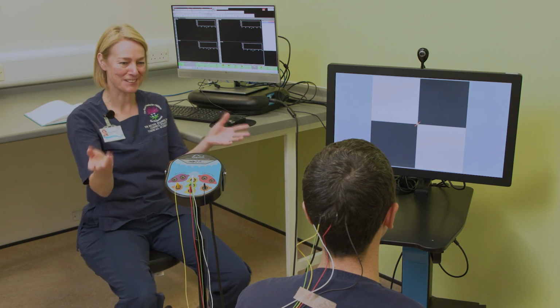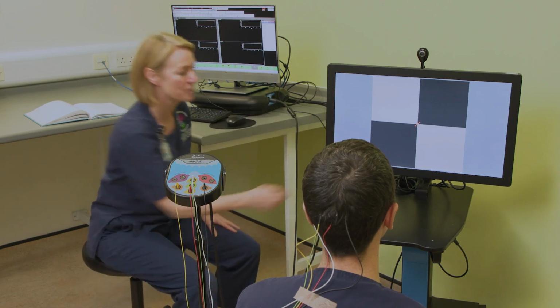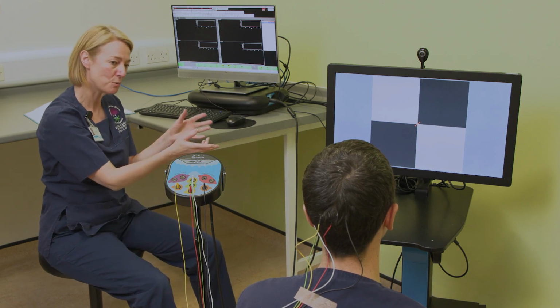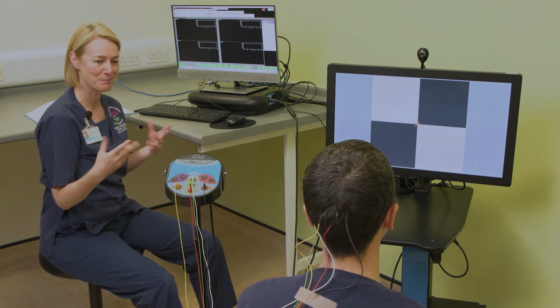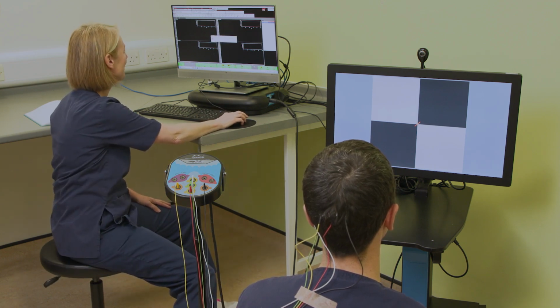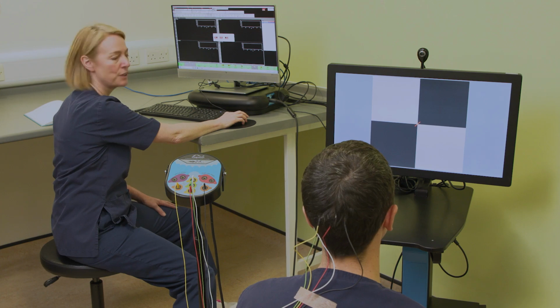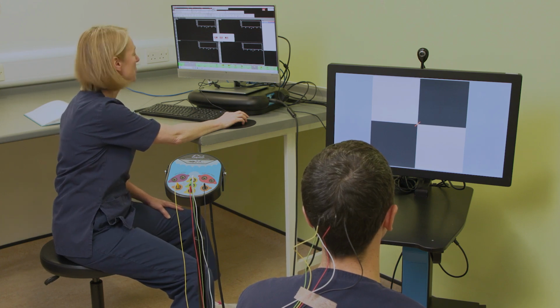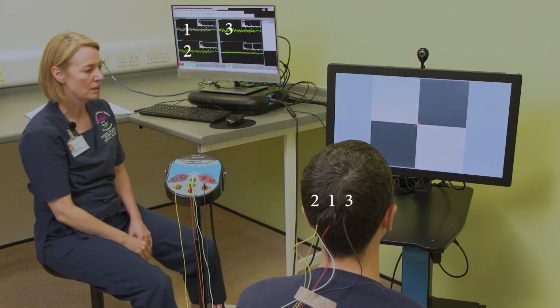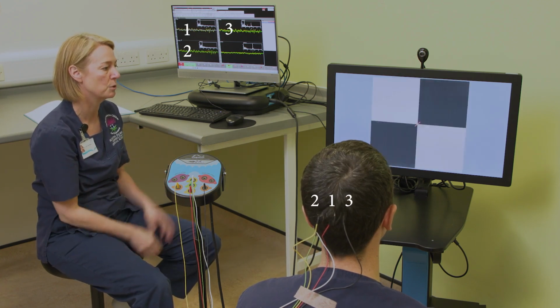I'm Ruth Hamilton, a clinical scientist working at the Royal Hospital for Children in Glasgow in the UK. And in this video, you'll see me testing my colleague, Bruce Hudson, who's acting as a patient for demonstration purposes. We're going to show you how the Diagnosis STEP VEP system works, a system developed by myself and colleagues here at the Children's Hospital. So you can see that Bruce has 3 electrodes across his occiput, a frontal reference electrode, and a virtual ground on his left mastoid.